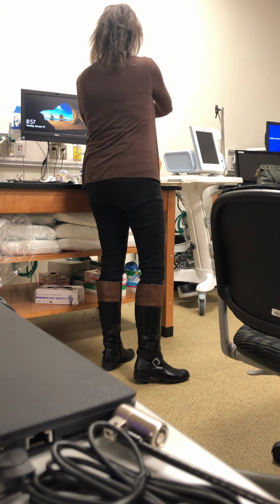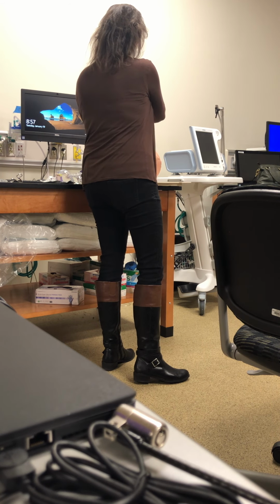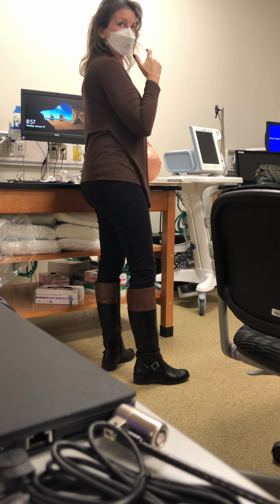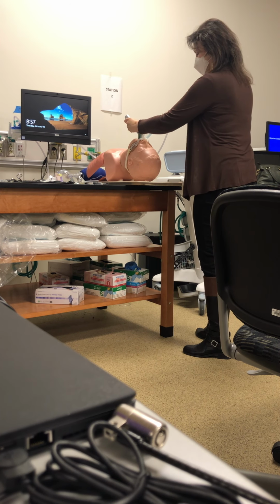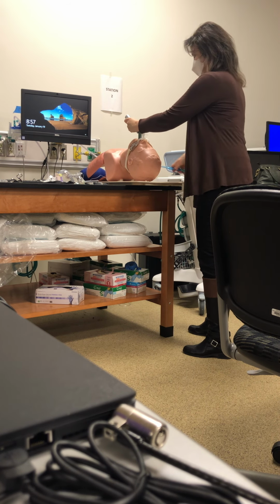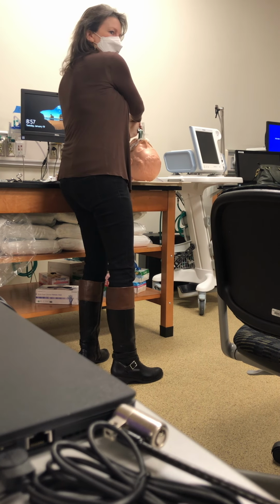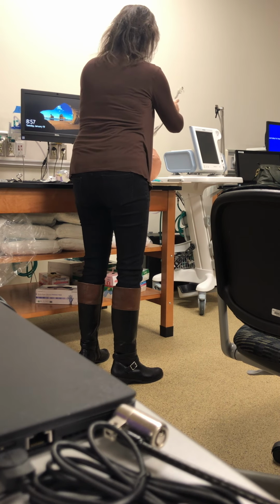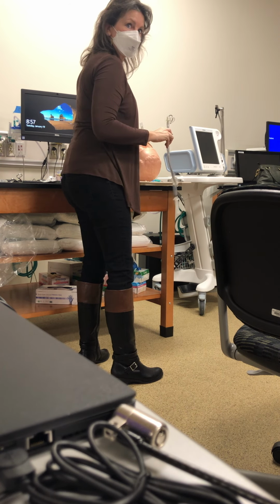These take a lot of strength, because they're flat, this material. You've got to lift up, because you don't want to rock backwards, you'll break their upper teeth. So, lifting up, I'm suctioning out the airway, and you can do that for the physician. As they lift up, they're looking through here, and they'll see the cords. They'll say, okay, tube, you place the tube to the right and go right through the cords because you're seeing the cords.